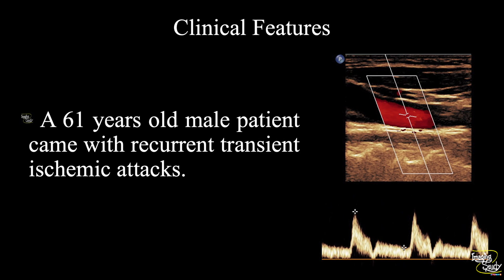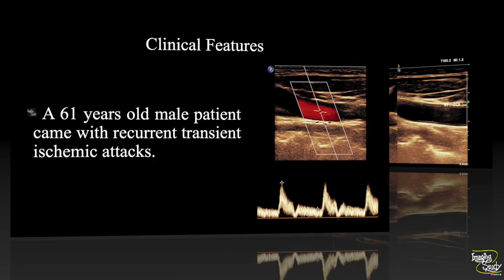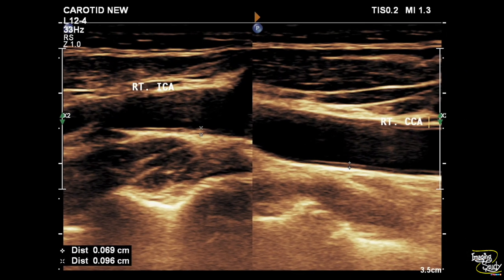Let's see what we have got on ultrasound. Here we have measured the intima medial thickness of the right common and internal carotid arteries. The intima medial thickness is slightly increased in the internal carotid artery.